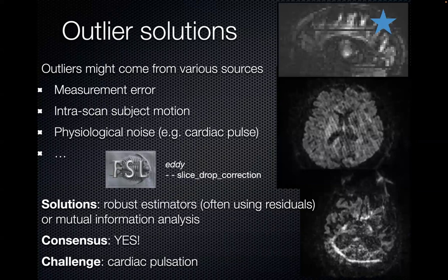Outlier rejection. I love these images, but if you start QCing your input data, you're going to see lots of crap like that. Lines, slice drops, artifacts. And funny enough, don't toss the data away yet. FSL now has options, slice drop correction. So by default in Tractoflow, for instance, we turn on all these options because they're critical for diffusion MRI.